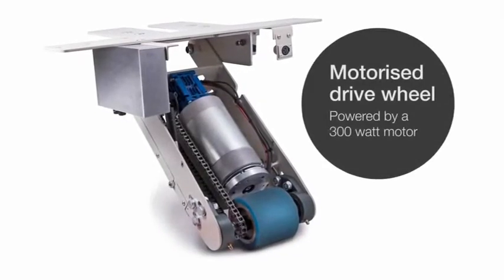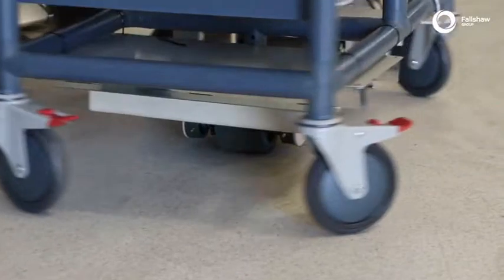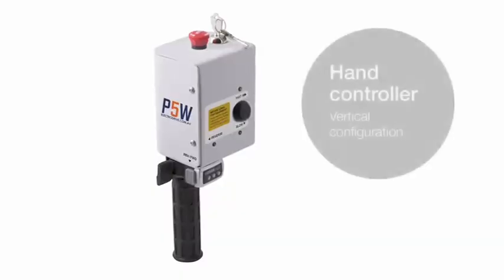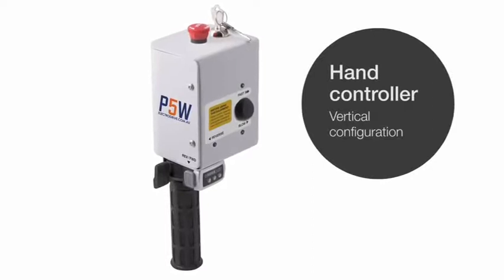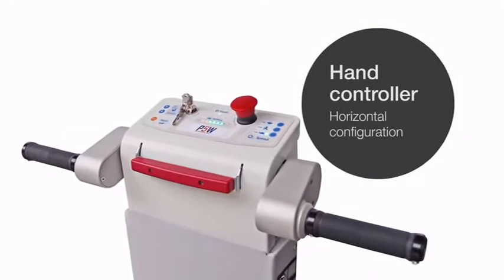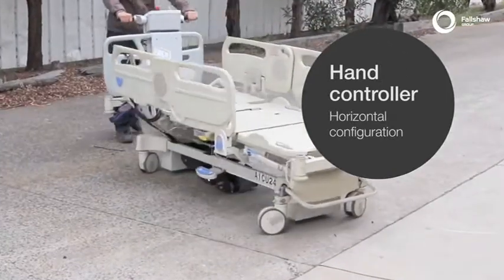The unit consists of a large motorised polyurethane drive wheel capable of moving up to 500 kilograms, and an ergonomic hand controller to fit trolleys or hospital beds, which can be configured for vertical or horizontal handlebars of varying widths and heights.